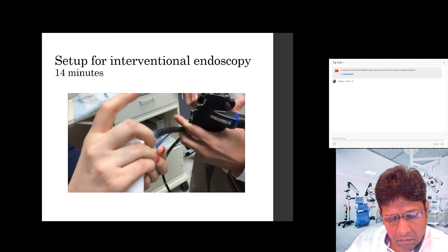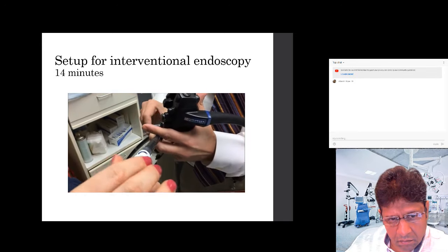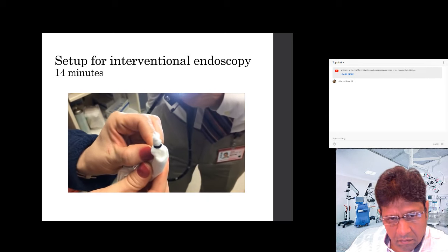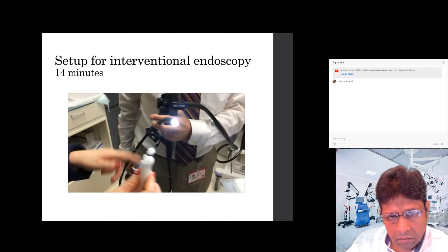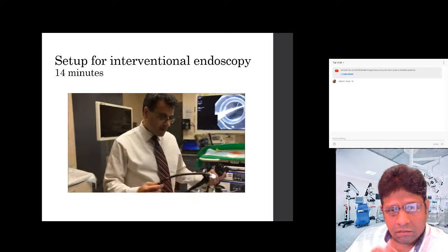Okay, good. And now if I deploy the next band, wait, I'm turning the wrong one. That's why. Here we go. Ready? That's it. It stays on. That's how it's going to take that. And how many bands are in that? It's a 6-shooter, so there's 6. Yep. And that is it.